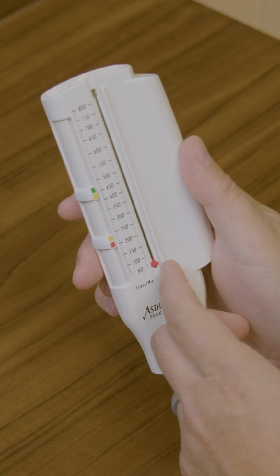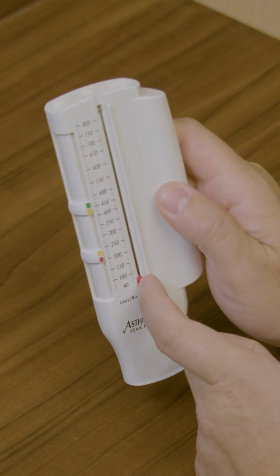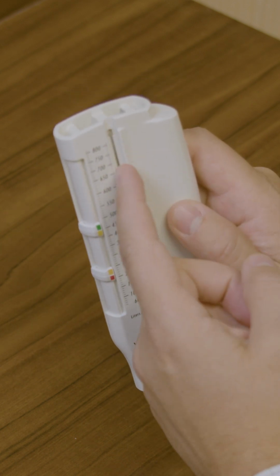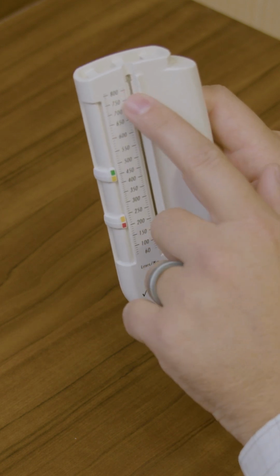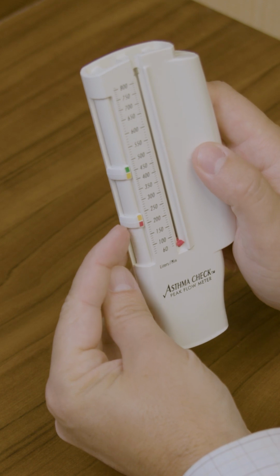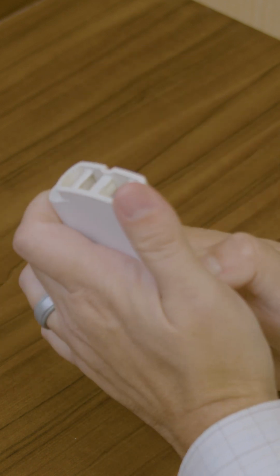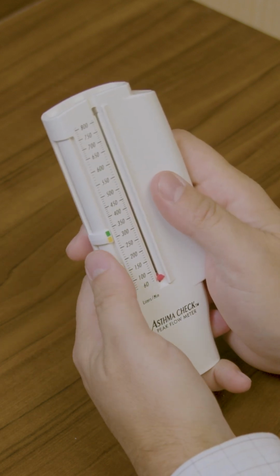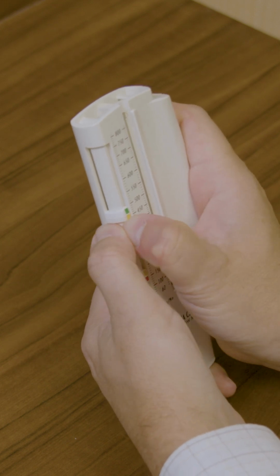As you can see, this is the mouthpiece, this is the exhaust, and this is the dial that goes up as you breathe out. So no flow would drop down to zero, maximum flow would go all the way up to 800 liters per minute. On the side are your zones. And so you can see that this can be moved up and down based on where your doctor has prescribed your zones to be.